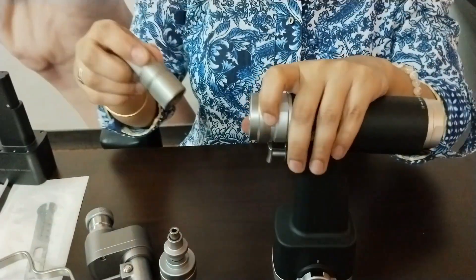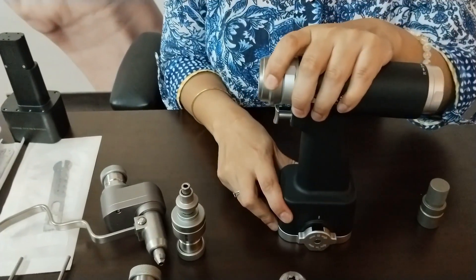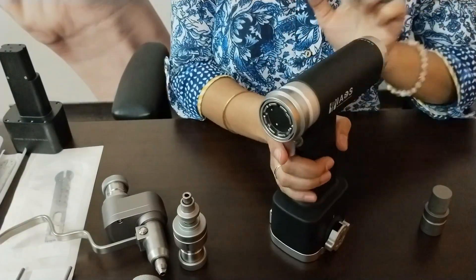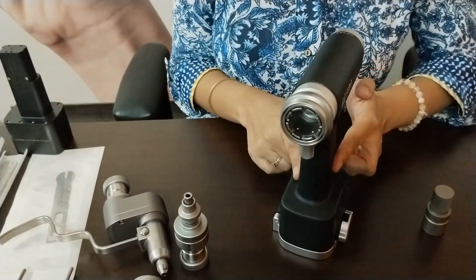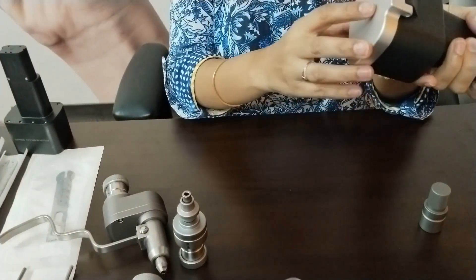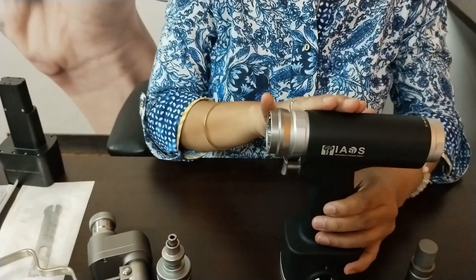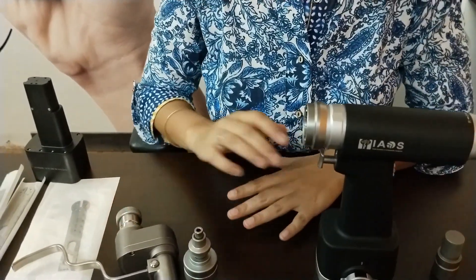When not in use, you can put on the chuck cover. There is a chuck lock which facilitates one-handed removal of the attachments, a wearable trigger for speed control, a battery casing, a lid for the battery housing, and a battery case lock. That covers the handpiece. Now let us move to the attachments.